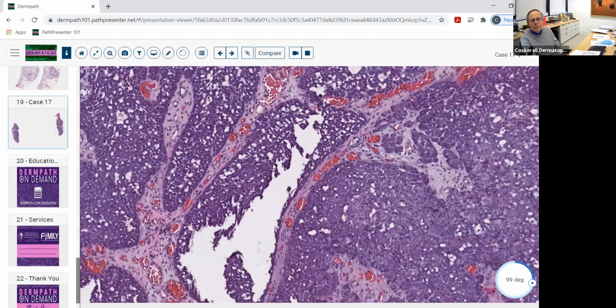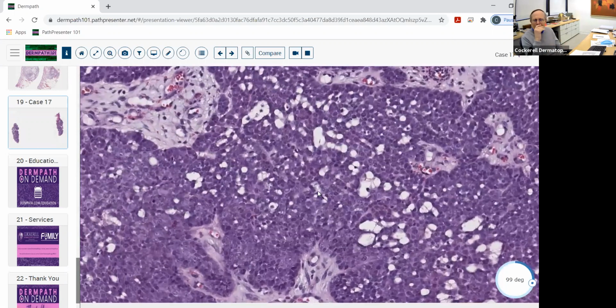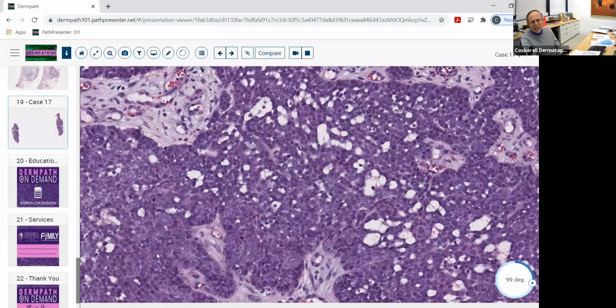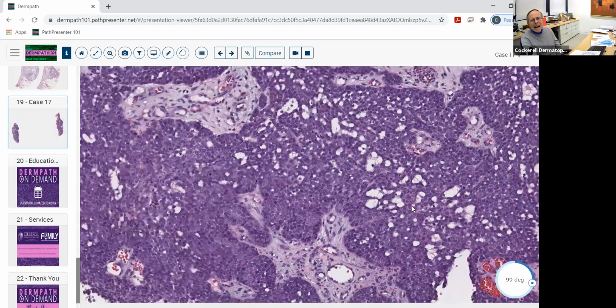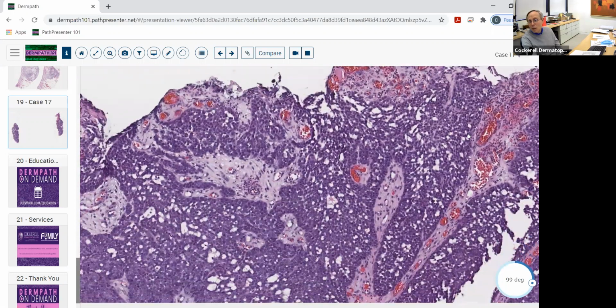So this is an example of a poroma gone bad. So this is a porocarcinoma. Relatively rare entity. I don't use the diagnosis all that much, mainly because most of these are kind of poorly differentiated basosquamous carcinoma. So if you're really going to make this diagnosis, you really need to see areas that are pretty classic for poroid differentiation, at least in some areas, and you need to see pretty good ductal differentiation. I found that when these lesions kind of become malignant, and here you see, well, maybe was this the silhouette of a poroma at one point? You know, maybe. I find that these things sometimes end up getting overcalled.